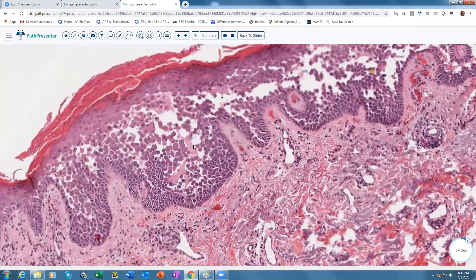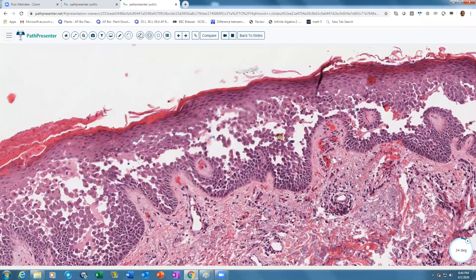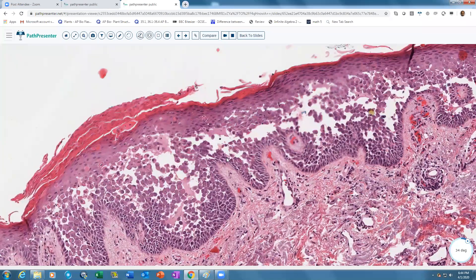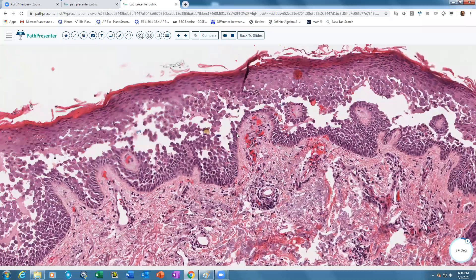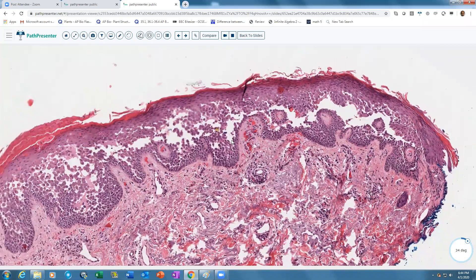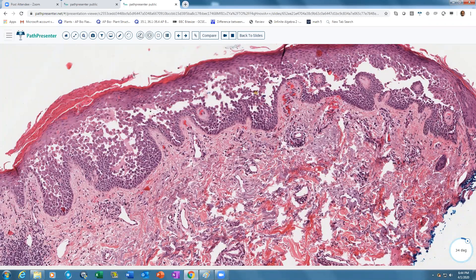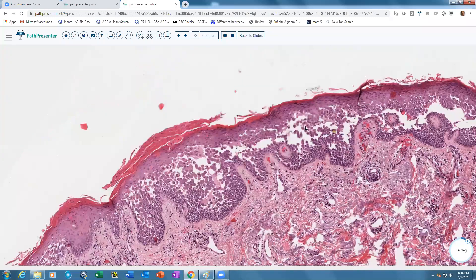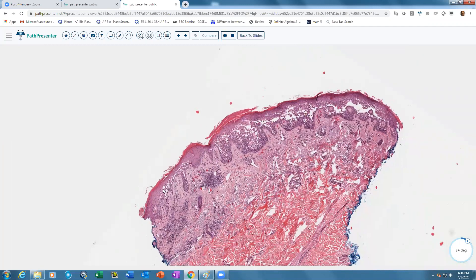At high power, the split contains numerous acantholytic keratinocytes attached to both the upper and lower layers of the split, giving the appearance of a dilapidated brick wall — sometimes even suprabasilar, which can be confused with pemphigus vulgaris. The diagnosis is Hailey-Hailey disease. Key distinguishing point: if a hair follicle is present, it is not involved in Hailey-Hailey disease, whereas it is involved in pemphigus vulgaris.